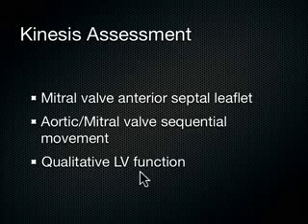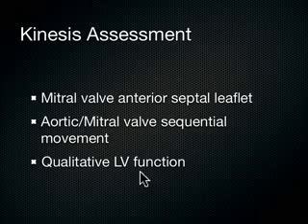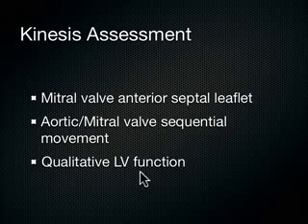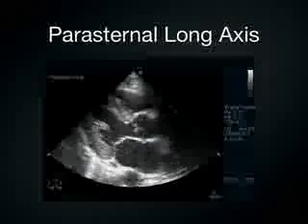I'm going to look at the mitral valve, the anterior septal leaf of the mitral valve, and how well that comes up and smacks into the septum of the heart. I'm also going to look at the sequentiality of the aortic valve and the mitral valve, how well they work together, and I'm going to look at the LV and how much squeeze is going on in the LV. So here's how I do this.